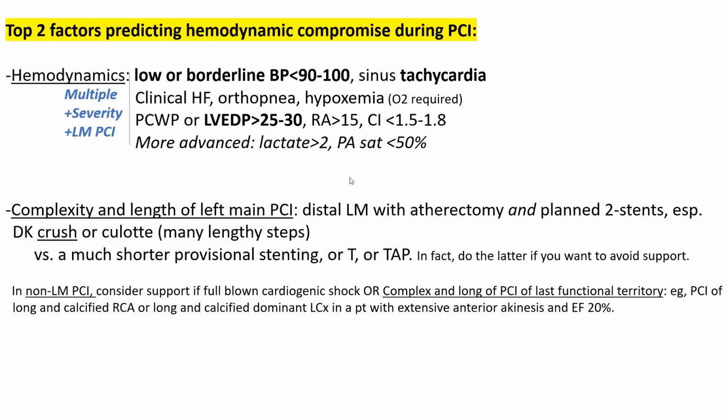And here's what I mean. First, I want to show you what in bad hemodynamics, this is one feature. You have a shrinking LV systolic pressure, and rising LV diastolic pressure. This is what you call a shrinking ventricular waveform. It's very concerning. When I see this, I'm very concerned that the patient is going to go in full-blown shock if he's not already, and PCI will put him there if I don't use support. Also, the same shrunken aortic pressure with narrow pulse pressure in conjunction with that shrunken LV waveform.